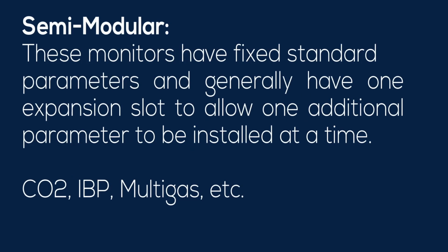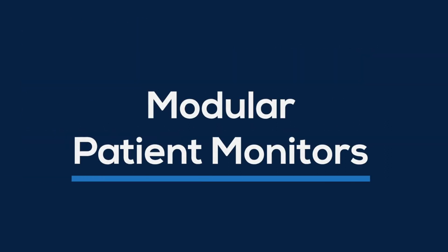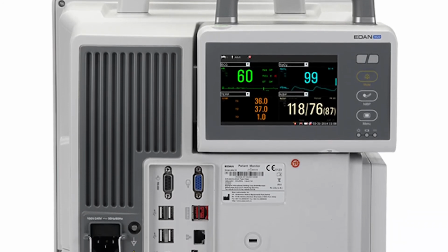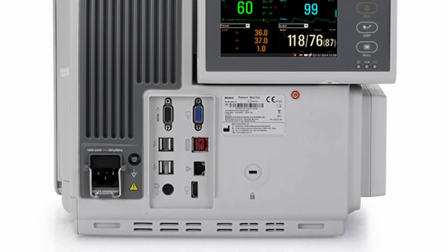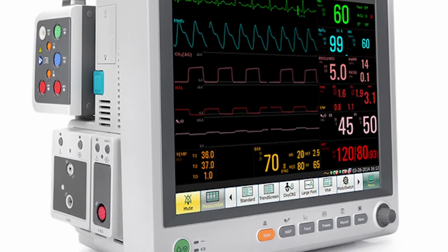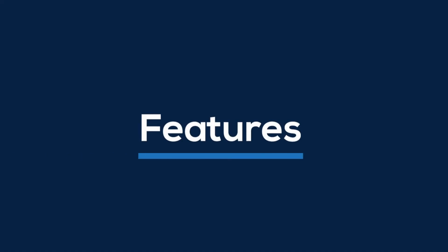That goes into semi-modular. These monitors have fixed standard parameters, but can generally have or allow an additional parameter to be installed at a later time, such as CO2, multi-gas, or IBP, invasive blood pressure. Modular patient monitors feature a completely different modular approach, meaning that the monitor itself is just a display and expansion slots. The main parameters would be added to the monitor in a multi-parameter module with several additional slots available for additional modules.